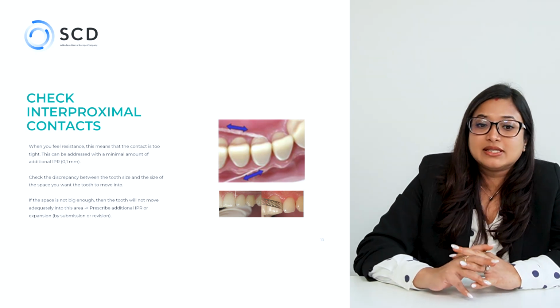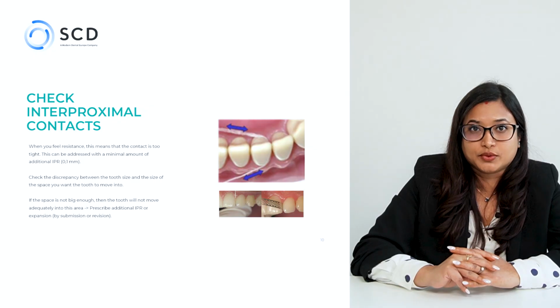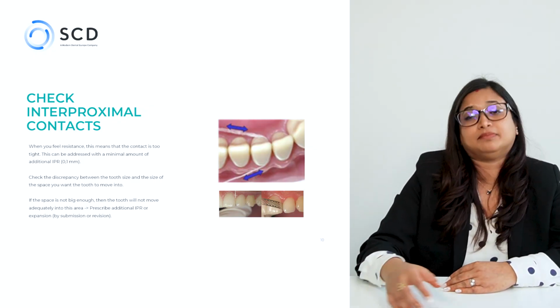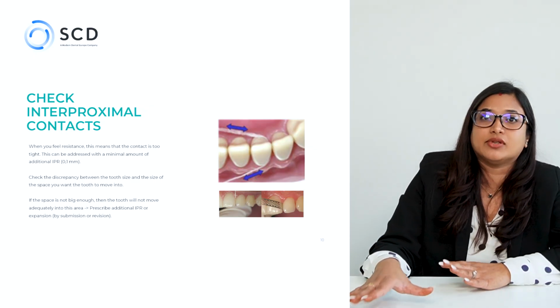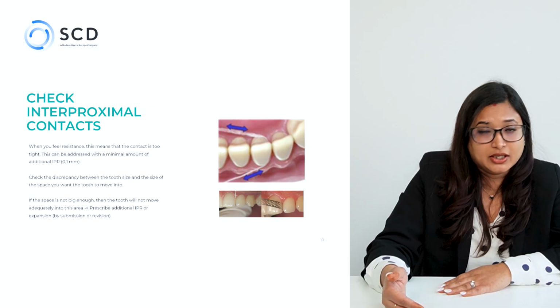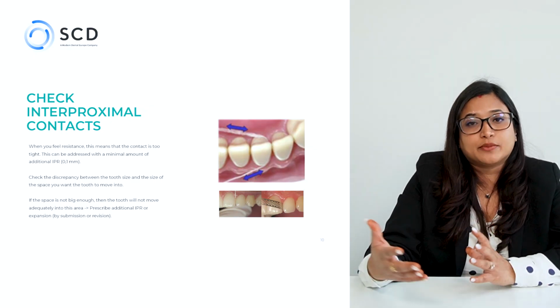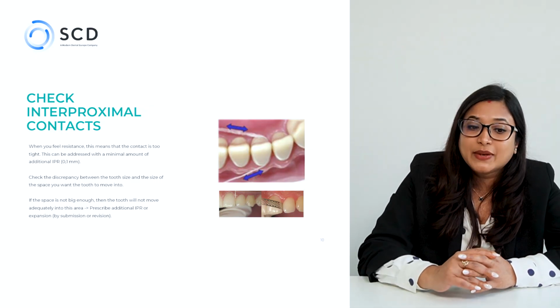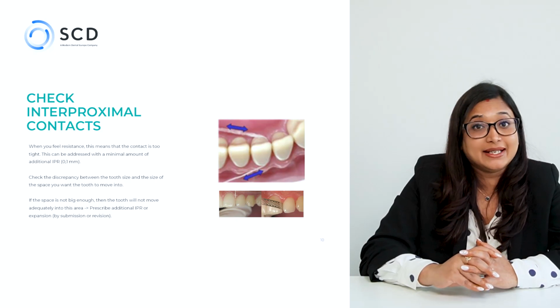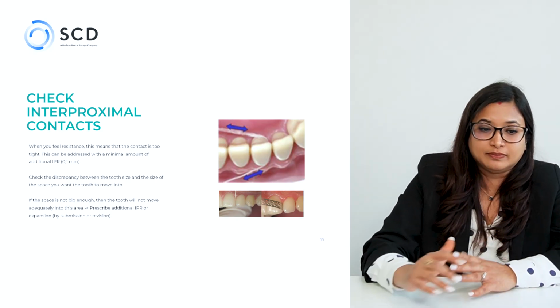And check the discrepancy between the tooth size and the size of the space you want the tooth to move into. We have planned a treatment plan, of course, but clinically also we have to analyze where we are moving the teeth, and whether there is enough space for its movement. If it is not, then it will cause the same problem: again, too tight interproximal contacts. If the space is not big enough, the tooth will not move adequately into this area. And in that situation, we will have to prescribe either IPR or expansion.